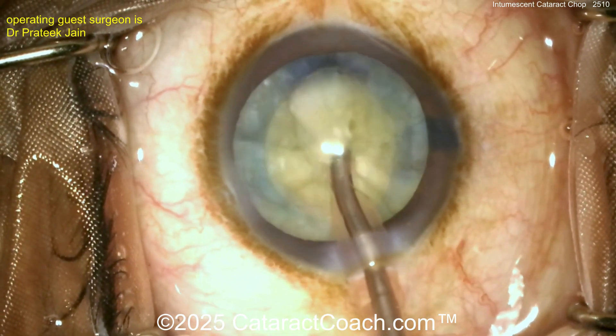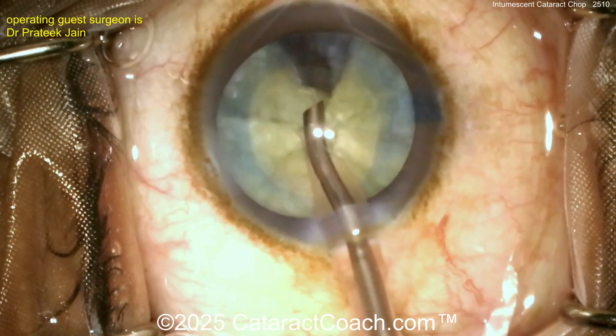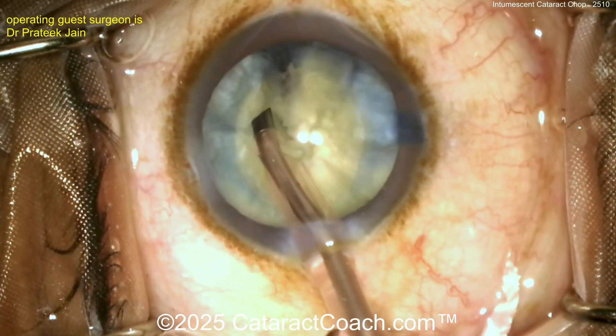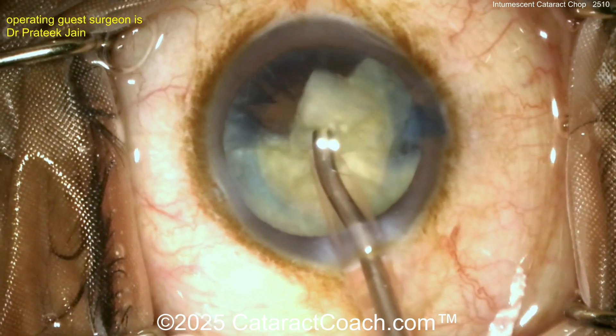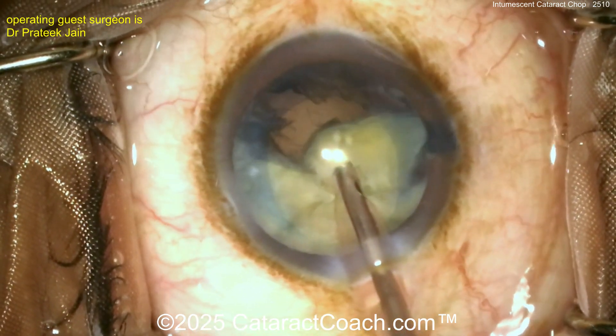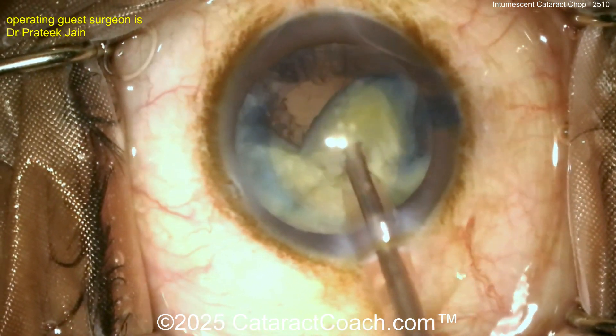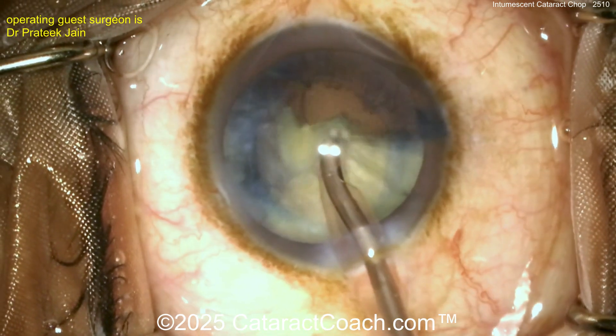Look at that — all the nuclear pieces have been chopped up and now the surgeon is using a one-handed technique to just remove the pieces. It's like you slice the pizza up into eight pieces and now you're just taking out each piece of pizza. I've been known to wolf down a whole pizza too — don't tempt me.